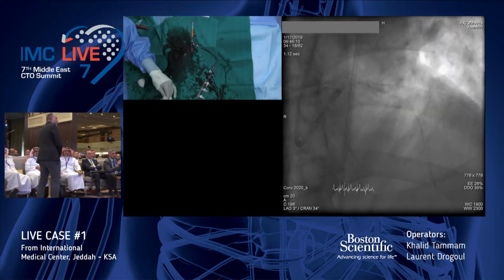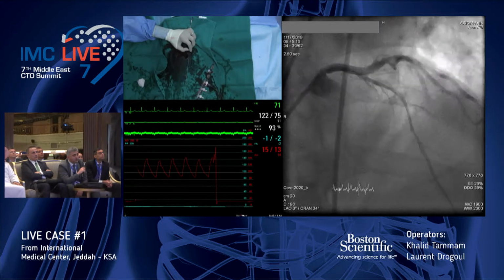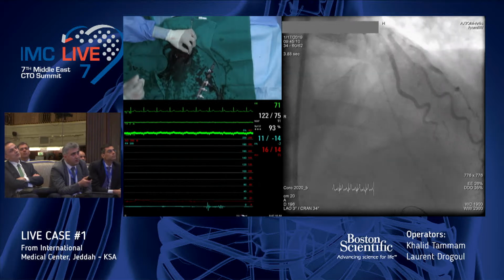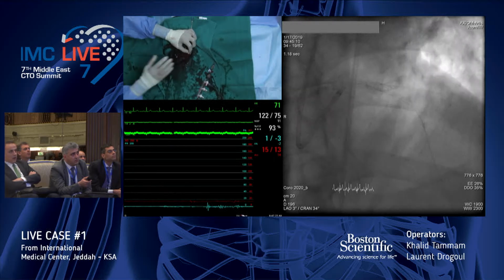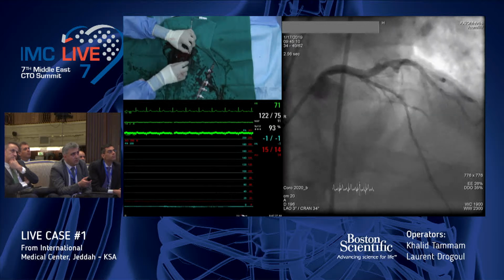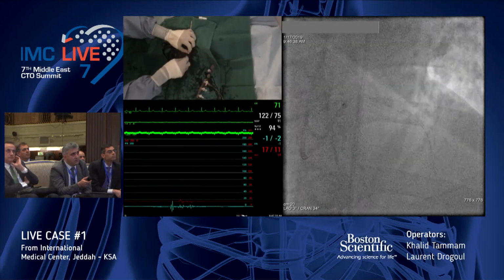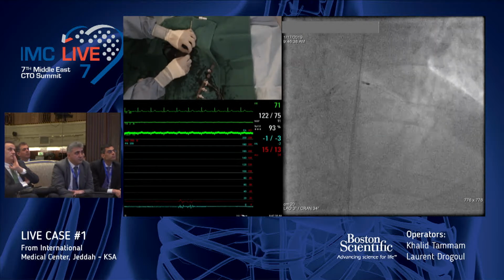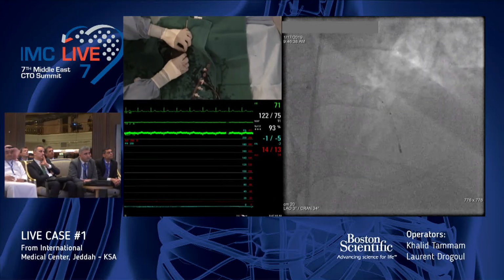So Ralid, the question here in the room is: why use IVUS now and not rotablator now? I just confirmed the calcifications by IVUS. Sometimes you have eccentric calcifications which can be broken easily with the scoring balloon or non-compliant balloon. And sometimes when you use IVUS, you say, okay, this cannot be done with any balloon. So with the IVUS, you can decide if you are using rotablation, a scoring balloon or a non-compliant balloon, just to study the calcification.